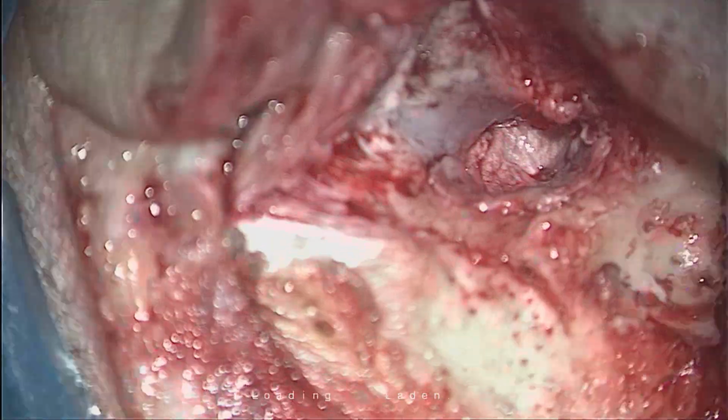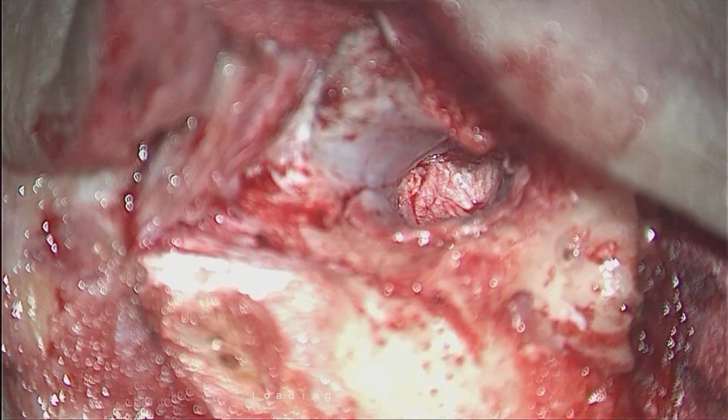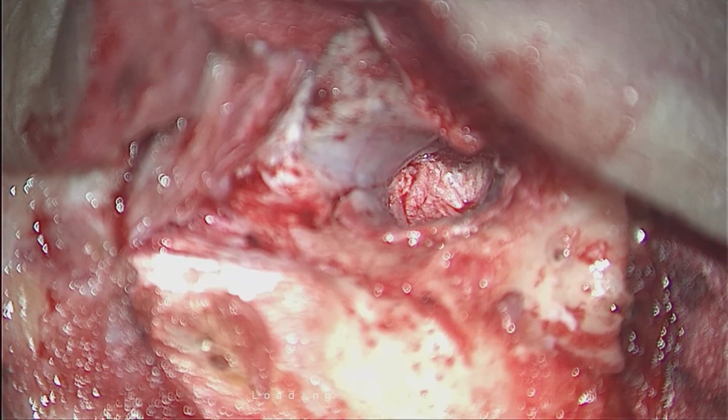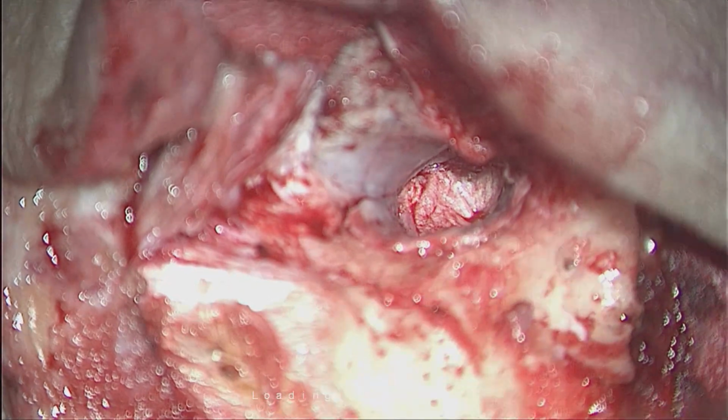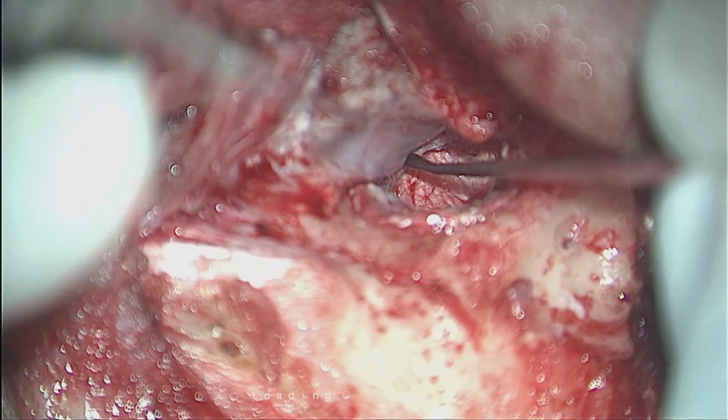Sir, anterior superiorly, should it be overcorrected? Not really. I have mentioned in the beginning that I have raised my flap beyond the anterior superior margin of the perforation to place this graft beyond the margin of the perforation. Yes. I will show it again, Sandeep.